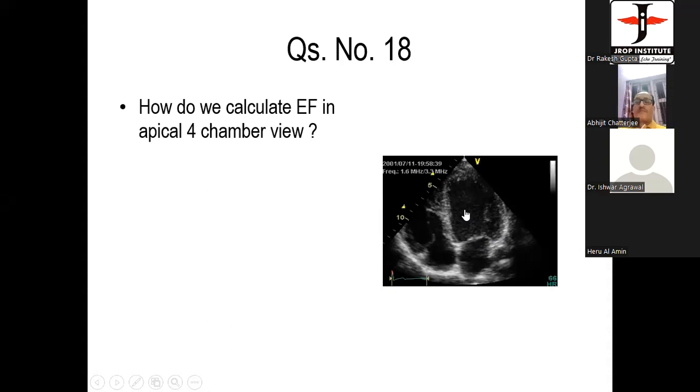Okay, sir. Next person, Dr. Anupa George. Dr. Anupa, can you hear me? Yes, sir. Have you been doing echocardiography in the recent past?